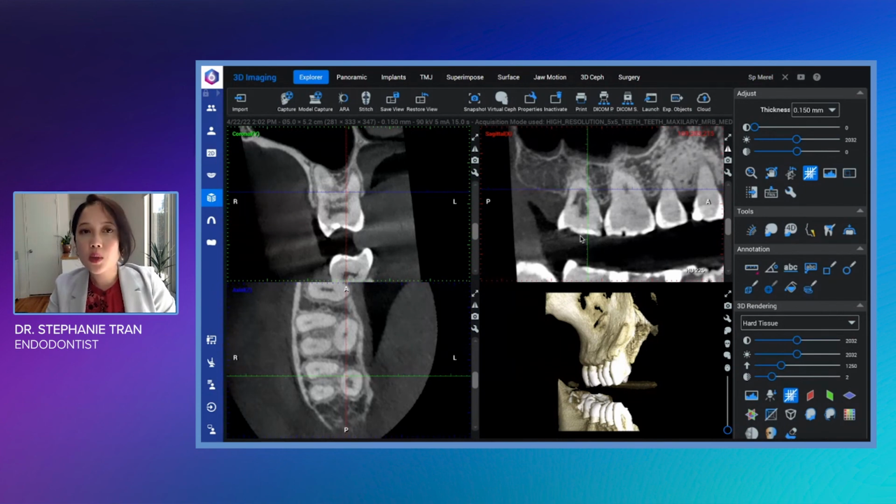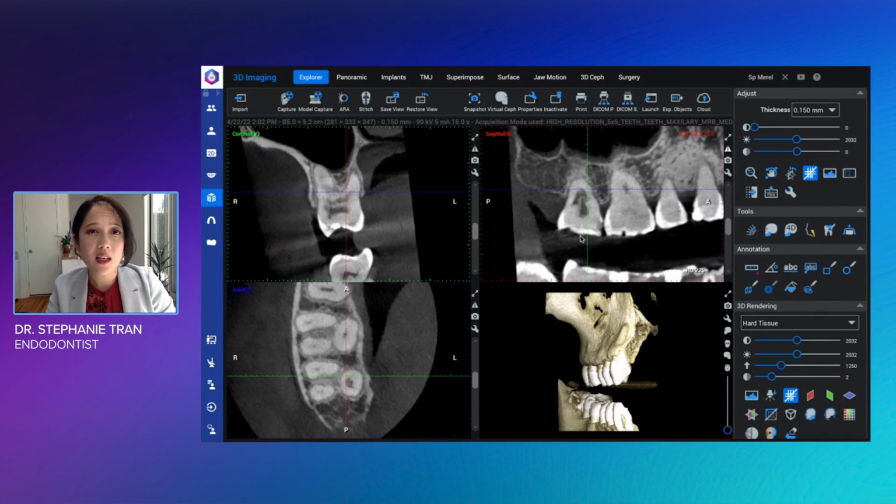So because of that, the patient was recommended to return to their restorative dentist for further evaluation of possibly restoring and then watching the external cervical resorption defect. Sometimes these things can just be maintained. It depends on if it's symptomatic and how involved it is, and there are many factors. So in this particular case, I'd say it depends. Sometimes the resorption can just stay inert, and you can just watch it over time in some instances. However, if it's very extensive, we would then have to recommend an extraction.